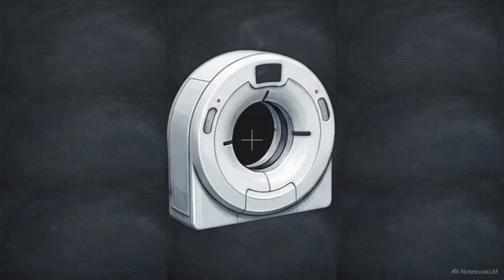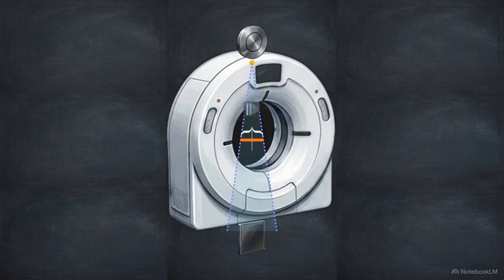The diverging X-ray beam projects the detector's physical width onto the bore's center, the isocenter, dictating the minimum gap to distinguish objects. Engineers bypass this using a flying focal spot. By rapidly shifting its position, the system multiplies projection samples, significantly tightening in-plane resolution.